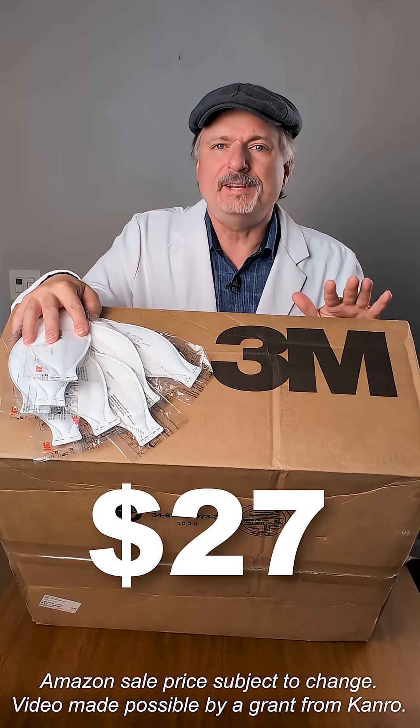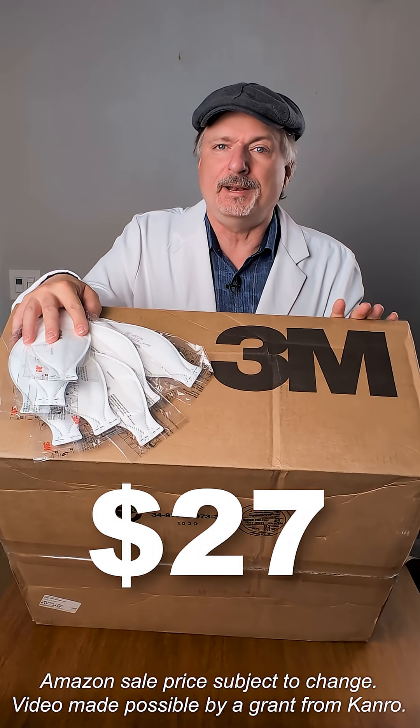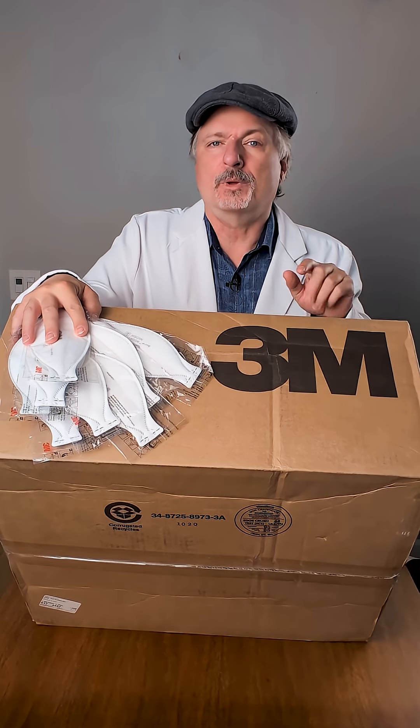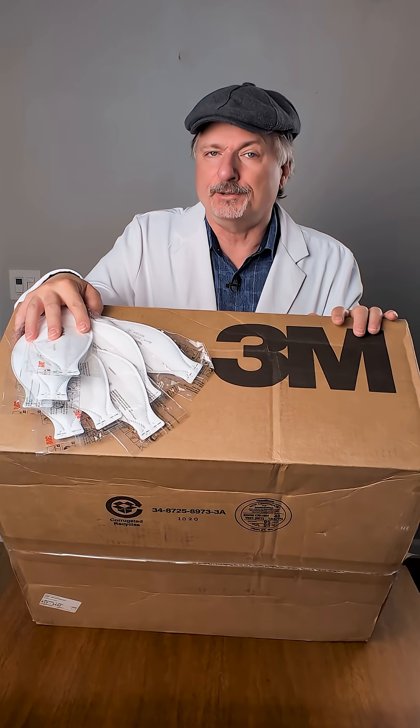Is this giant $27 box of 3M N95s from Amazon a scam? We're going to find out, and we're going to take a look at how you can find out for yourself. Only 3M can know for sure if something is counterfeit, so contact them if you've got questions. Now let's take a look at this box from Amazon for some clues.